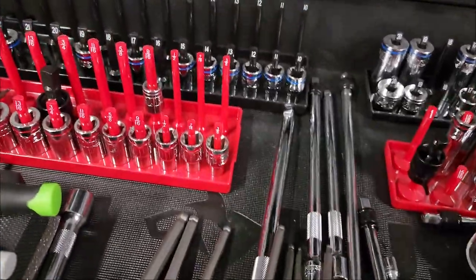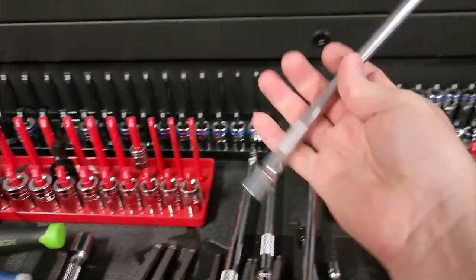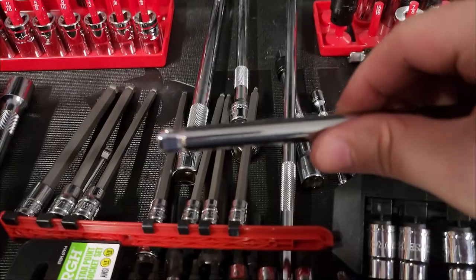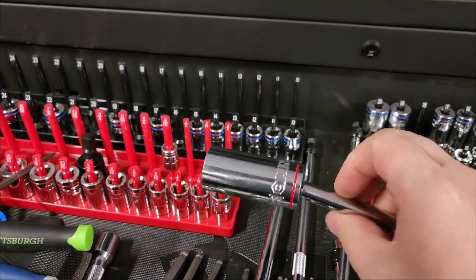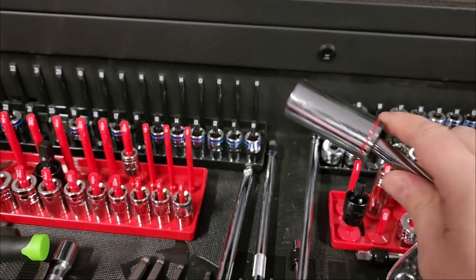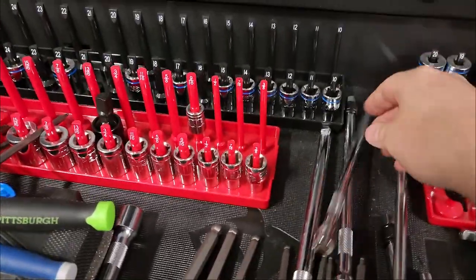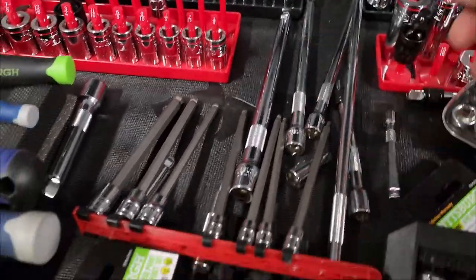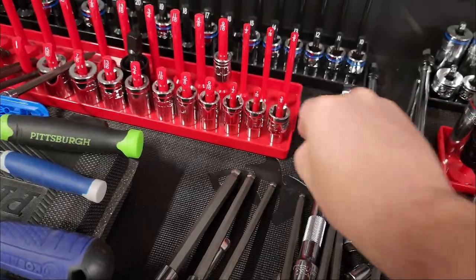Then you have extensions. There are many different types — one very useful one is the wobble extension. The head has a special cut that allows the socket to wobble back and forth slightly while still being driven, so you don't need a U-joint and can still deliver most of your torque. Extensions also come in half inch, three-eighths, and quarter inch drive sizes.